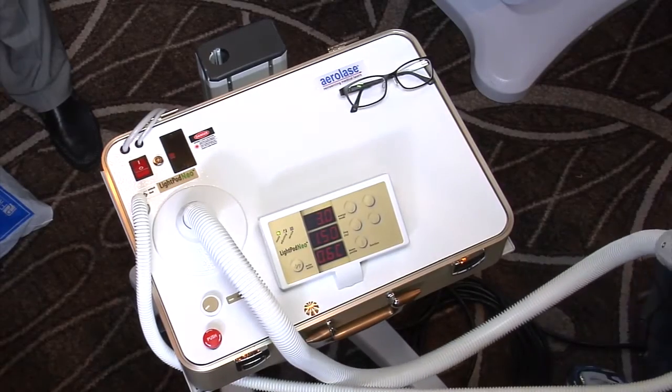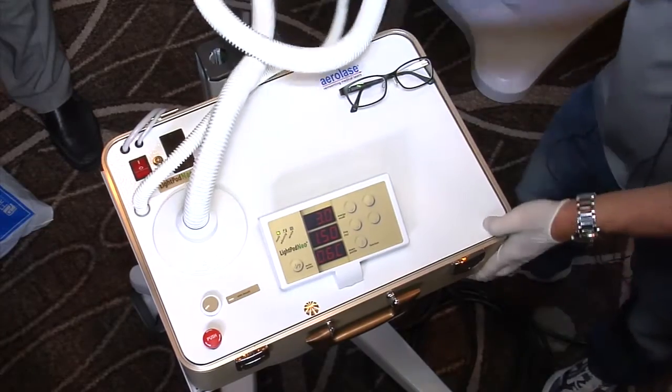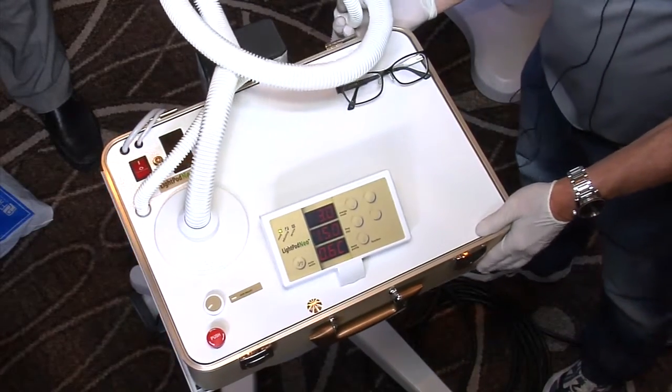I think it's a nice thing for people to see how compact this device is. Can you see the box? I mean, this is it — this is the whole laser, the whole kit and caboodle.